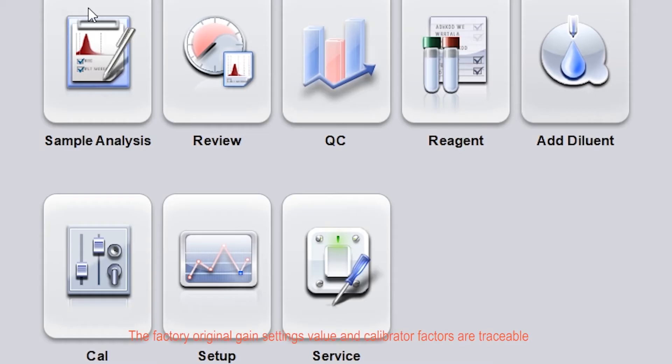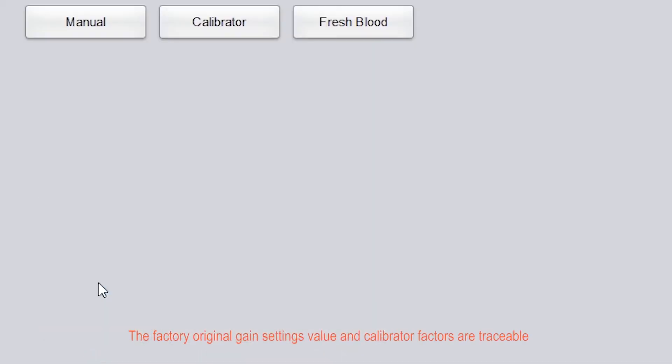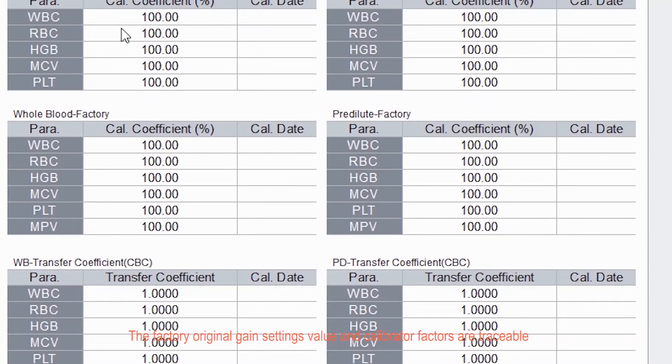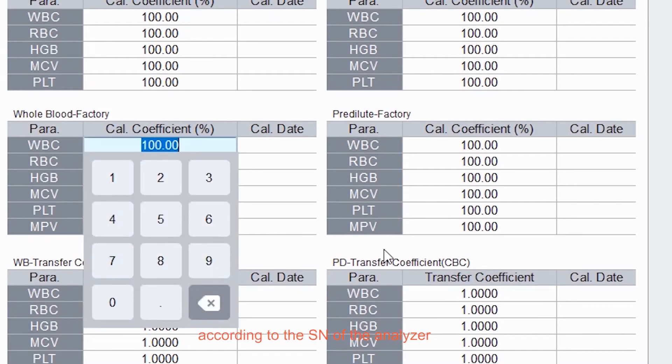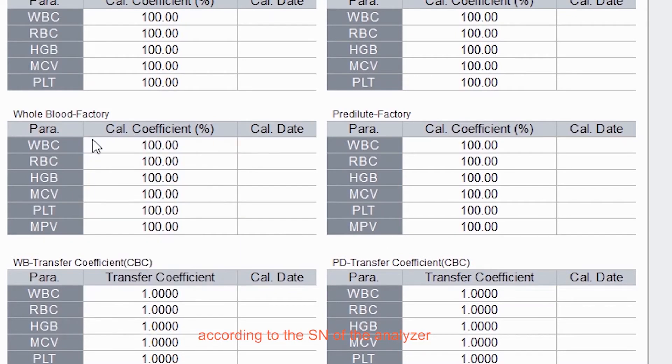The factory original gain settings value and calibrator factors are traceable according to the SN of the analyzer.